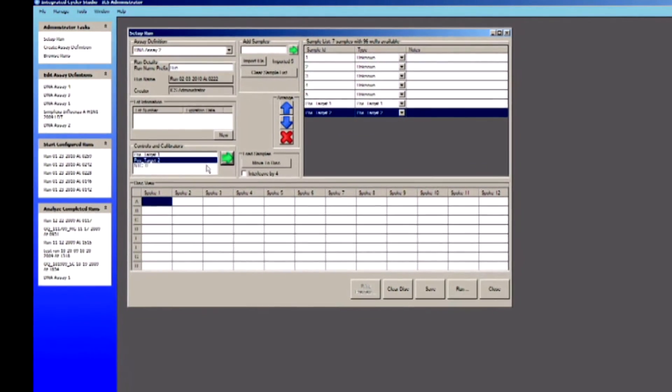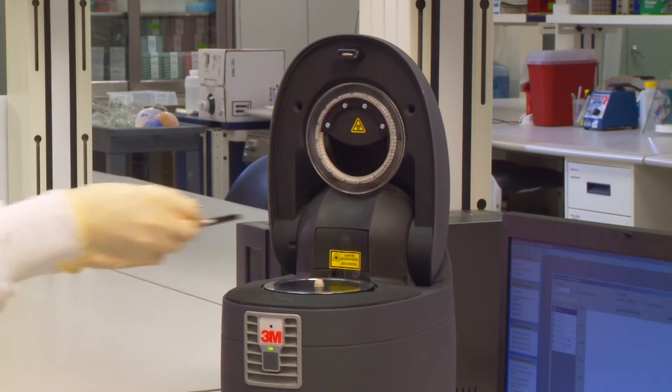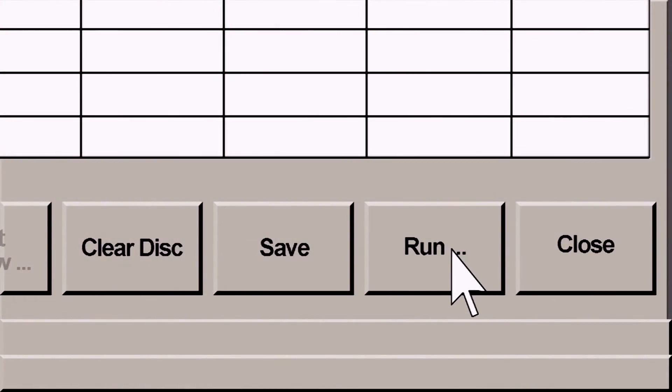Integrated Cycler Studio software notifies users to make certain that appropriate controls are added during a run setup. Place a disk on the platen, shut the lid and press run.